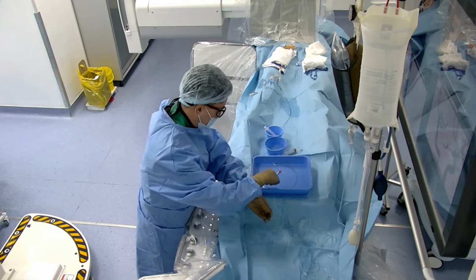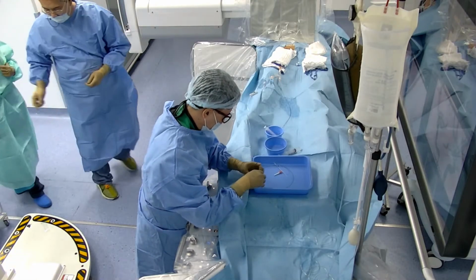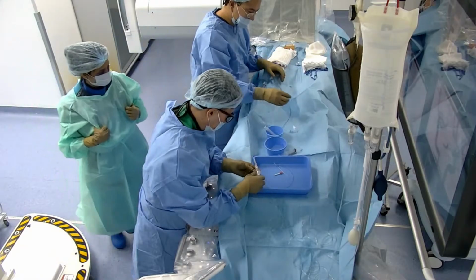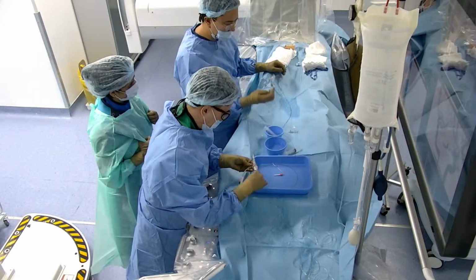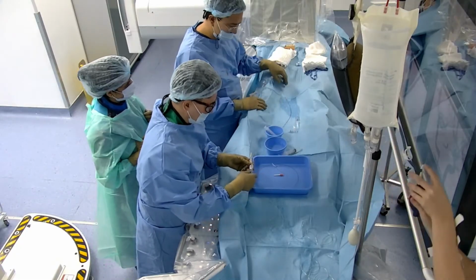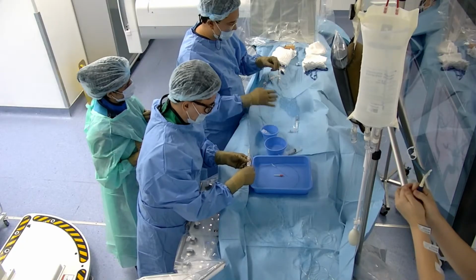Okay, let's go. And the patient was bypassed. It was a middle meningeal STA to ACA territory bypass, and he was planned for microsurgery or endovascular treatment.